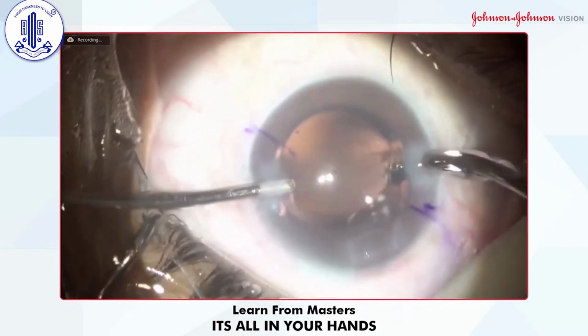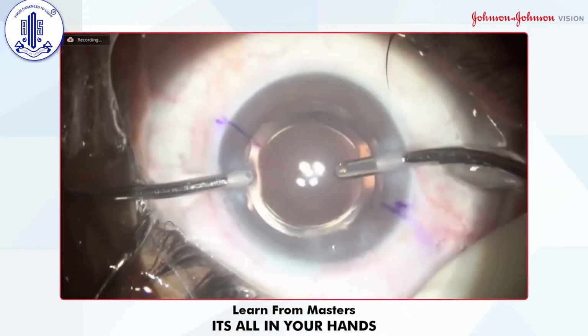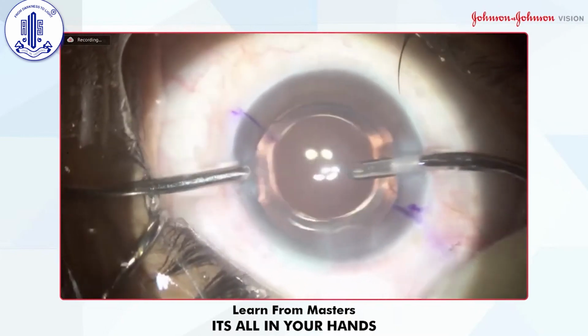And keeping this axis, again all the 3 Purkinje's images should be neutralized, make it one line, and you can see it's exactly at 180.